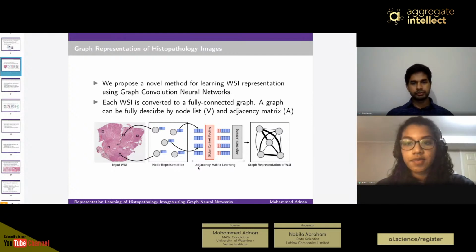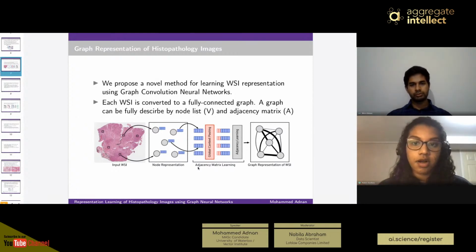Okay. And what would make the most sense to the doctors in terms of this matrix? Like if I'm the center node, I should be connected to all my neighboring nodes, or only to the top left ones, or is there some sort of domain knowledge you have in this area? Yeah, according to my understanding, suppose I have two patches that contain cancer, right? Those patches must be connected to each other.